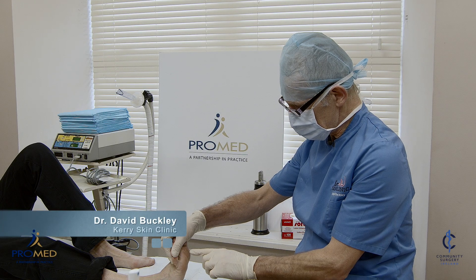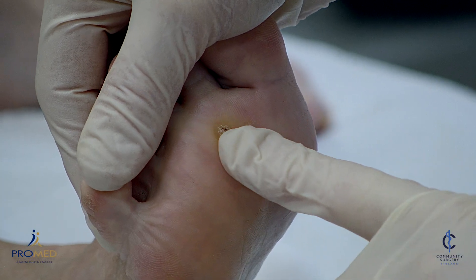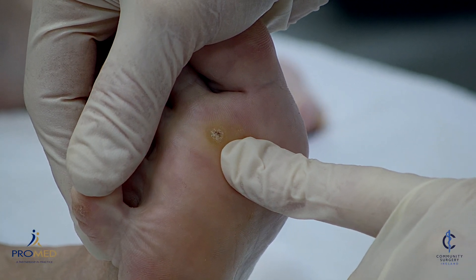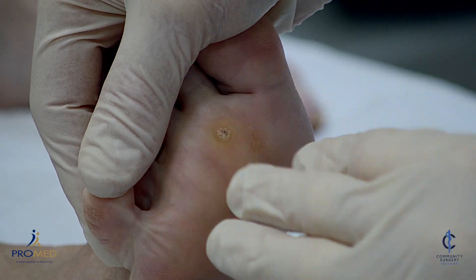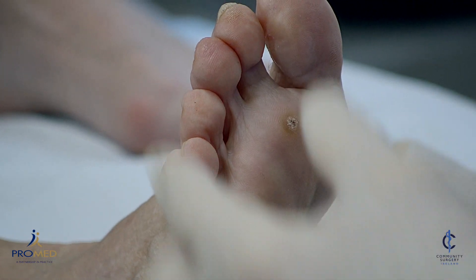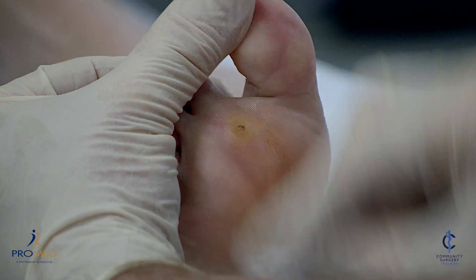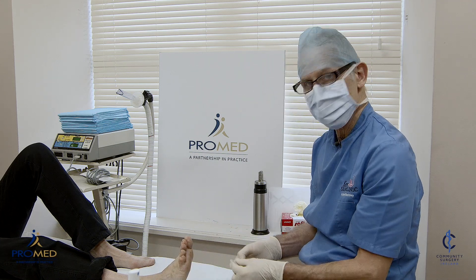This afternoon we're going to treat a plantar wart on this lady's foot. She's 60 years old. It's been here for about two years and it's painful and a bit uncomfortable and needs to go. So we're going to put in some local anesthetic first. It's quite painful to do this treatment without local anesthetic, so we just use one percent lignocaine.